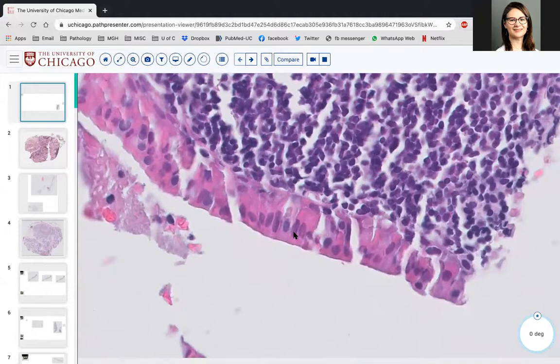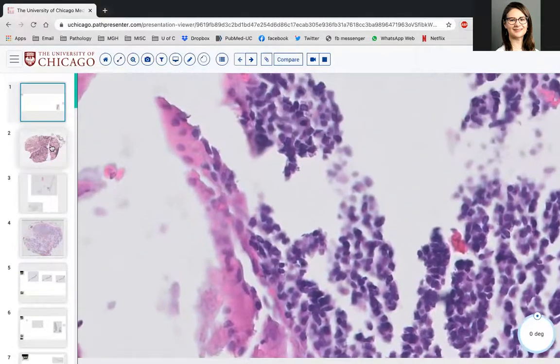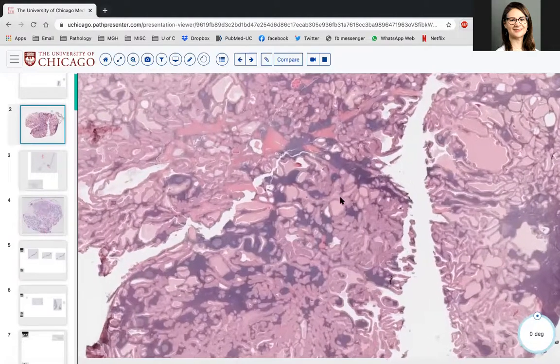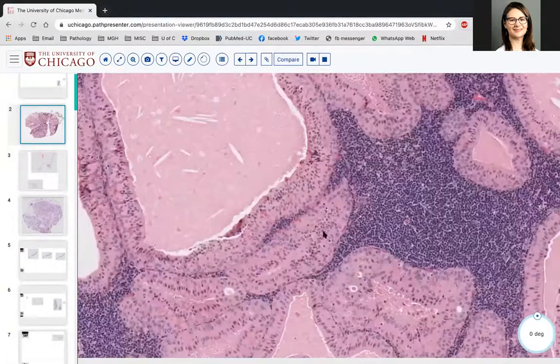Right. Awesome. The one caveat I will say is that most salivary gland biopsies happen on FNA, rather than core. But core or even shave biopsy of a mucosal site does come through, as you have seen in this presentation. So always be mindful that the same features that you want to see either on the FNA or on the resection may or may not be present on the core. So exactly, this is pretty much a classic Warthin tumor.